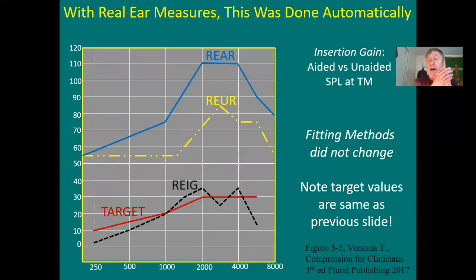So now you are looking at a non-behavioral thing. Very quick. How long does it take to do R-E-U-R? Not very. Okay, probably 10 seconds. And you've got R-E-U-R done. Then you put the hearing aid on top of the tube in the guy's ear without moving the tube.